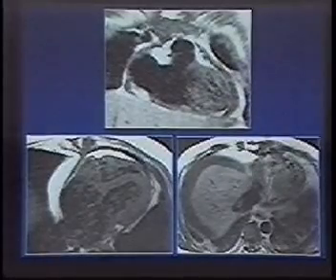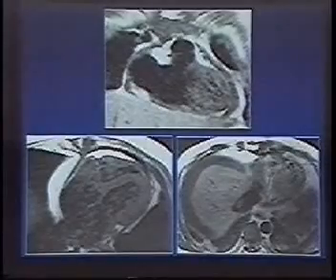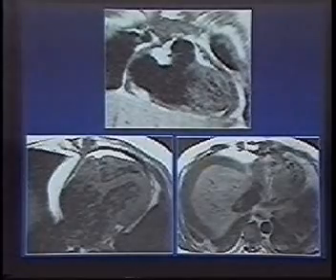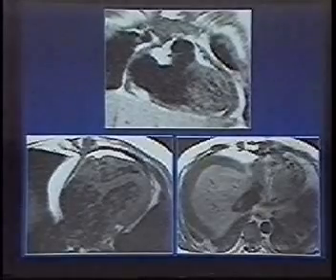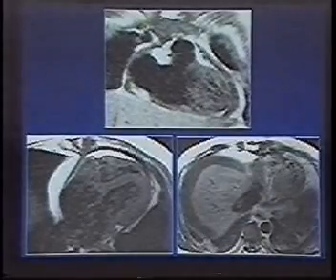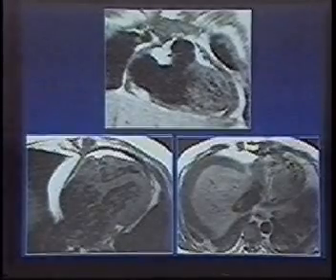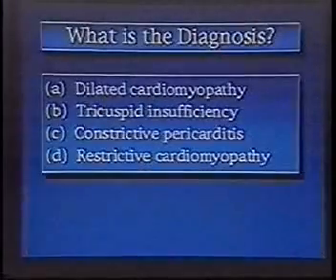So it's important, when you get the patient referred, constrictive versus restrictive, to do an MR and look for pericardial thickening. 4 millimeters or greater is abnormal. And if you happen to see pericardial thickening in some random patient on CT or MR, that is not constrictive pericarditis unless they have that particular physiology. So they have to come with the clinical question: does this person have constrictive pericarditis or restrictive cardiomyopathy? Then you can do the MR or CT. And we usually do MR because the images are much clearer.